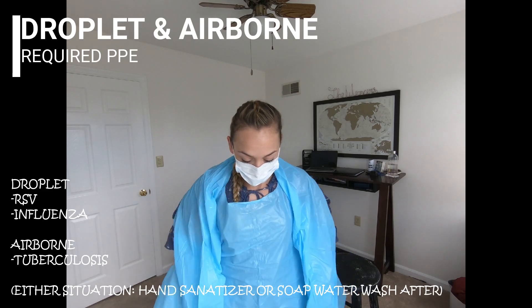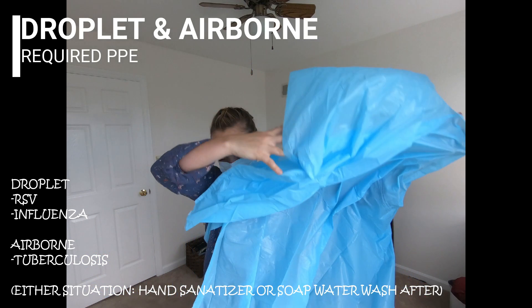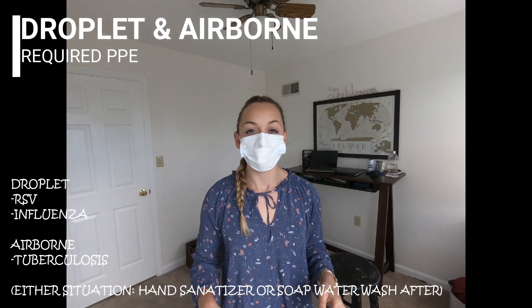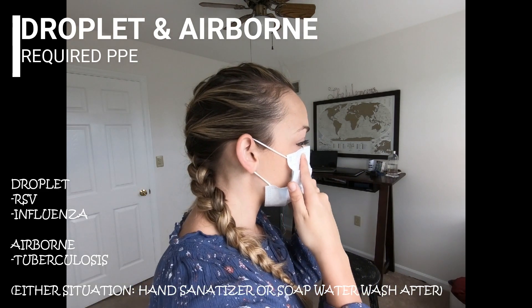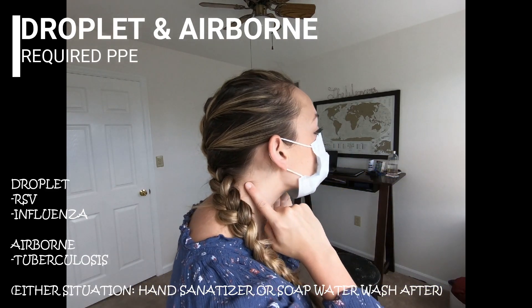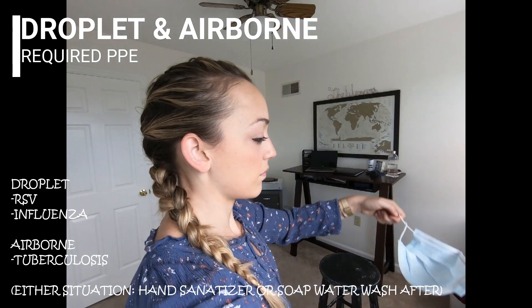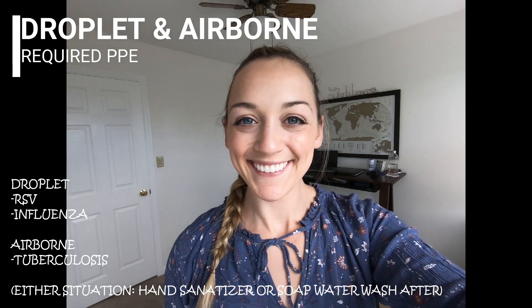Now for the removal process: take the gloves off first, then rip the gown off — never going over your head. Next, for the N95 mask, never touch the outside. Take off the bottom strap first — it is the opposite of how you put it on. Bottom strap comes off first, then your top strap, and remove it over the top of your head. And that's how you take an N95 off.